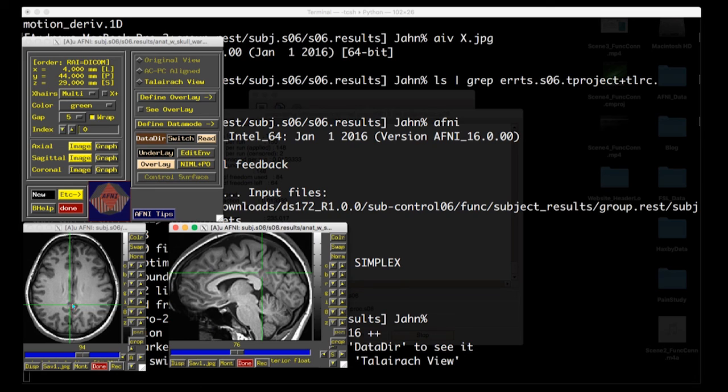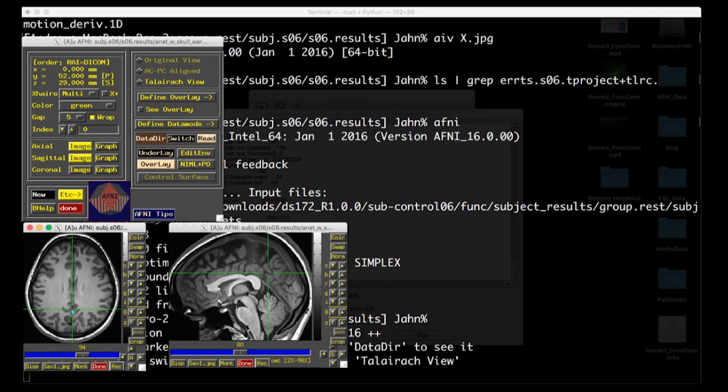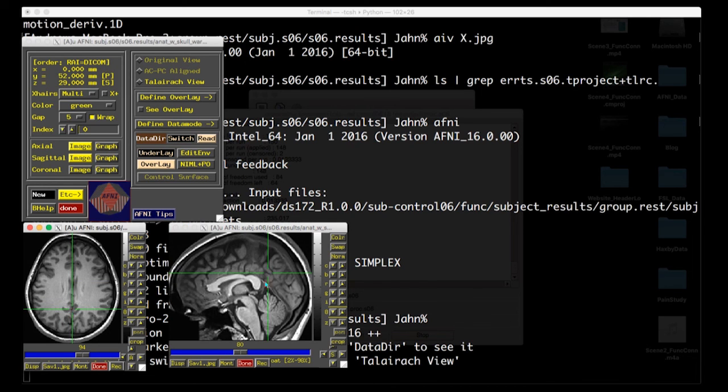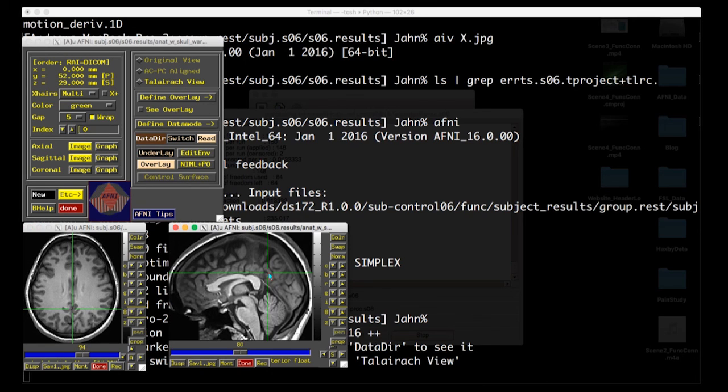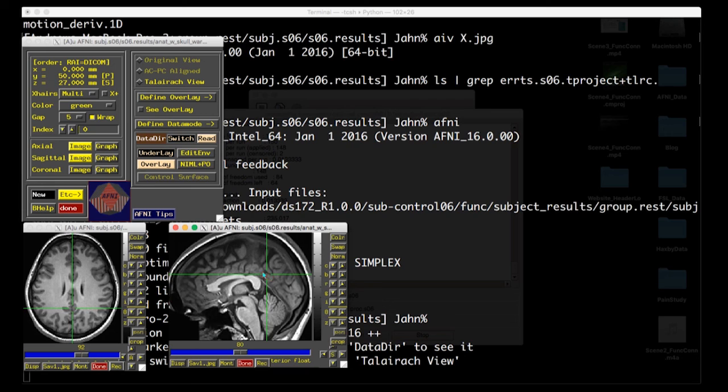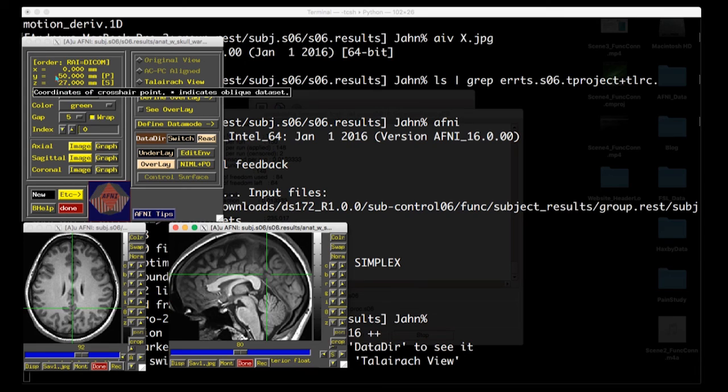So knowing that and knowing that error time series is what we're going to be using, let's decide on a good candidate region for doing our resting state analysis. Remember, this default mode network is what I was going to focus on. So right here, say this posterior cingulate cortex, let's say I have something like, let's find something right on the midline right here, say zero and how about right there. So note the coordinates right here 0, 50 and 27.